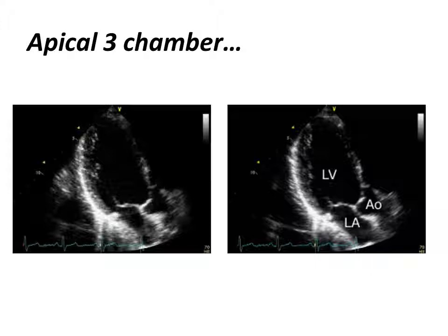So why are we doing parasternal long in apical, say for example? Well, the utility with this view is that you are able to measure a lot of gradients across the Doppler, and that's why we do this view. But you could well argue that if you have had a very good parasternal long, then this does not really add much information. Okay.